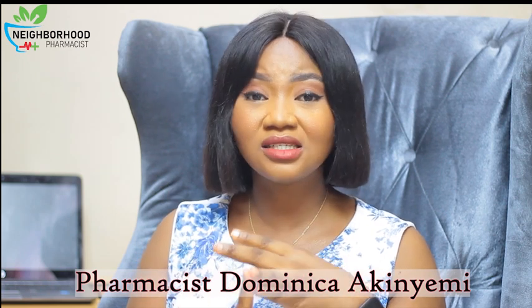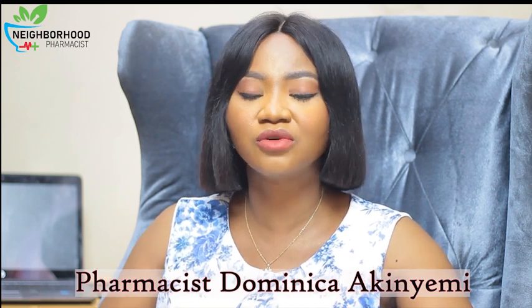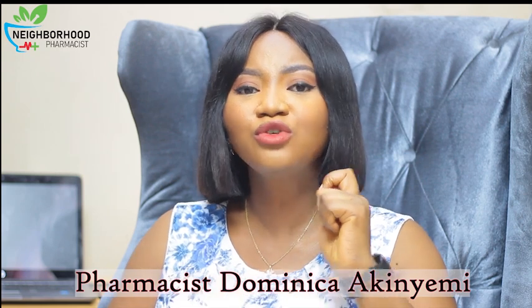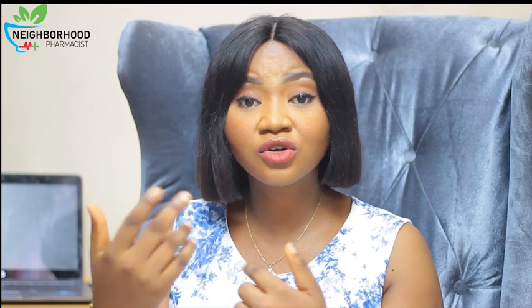Higher than that, 39 to 40, the person is actually febrile, like we would say. And then a high fever is anything from 40 and above. Now that person should not even be in the house. So as much as possible, using a clinical thermometer, you can know for a fact that this person is running a fever. Especially mothers of young babies, please get one. You will always get a clinical thermometer, or the non-contact thermometer, in a pharmacy. Please buy and have that at home.